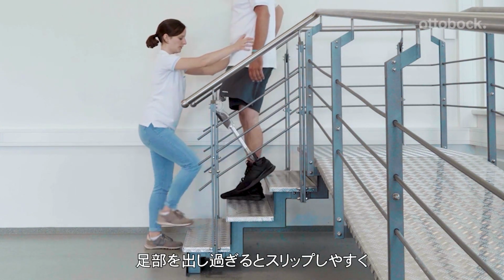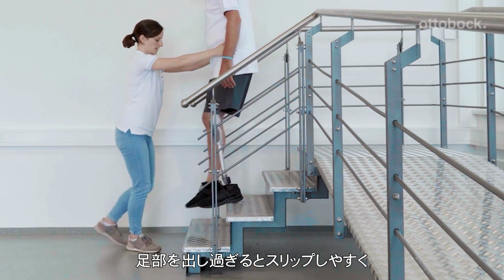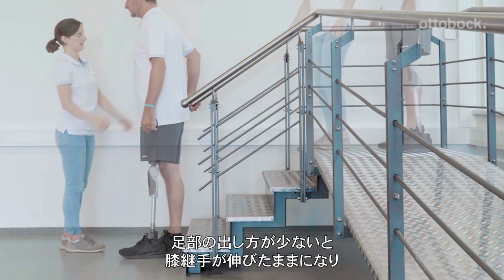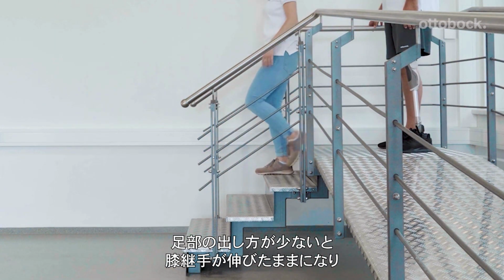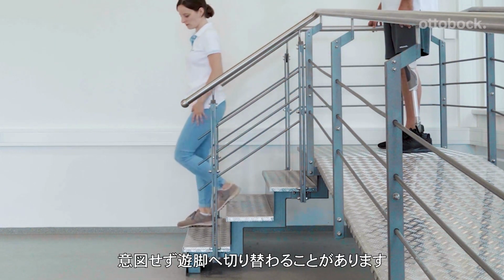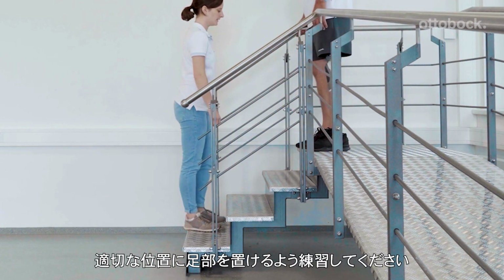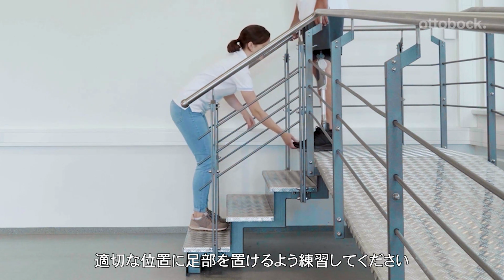The foot can easily slip if placed too far forward. If it is placed too far back, the knee may stay extended, or stance release can be triggered accidentally. Proper foot placement is also important for walking downstairs step over step.